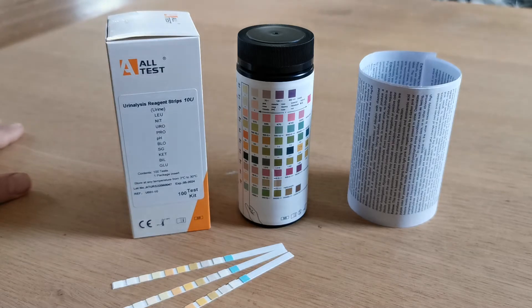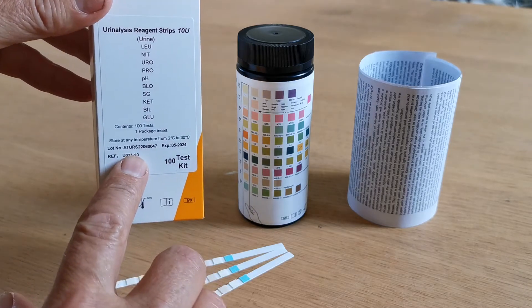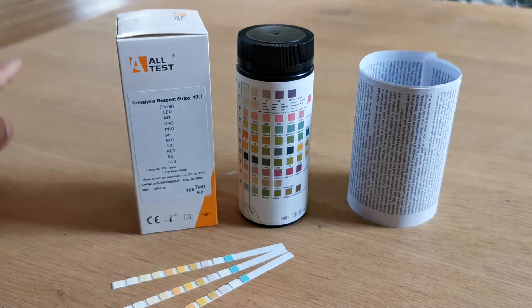That will ensure longevity, but as with all urine testing strips, within the parameters of the expiry date which will be listed on the side of the vial, once that foil is broken, the manufacturer's recommendation is to use the test strips within three months. If you keep the lid on and dry and the test strip pads don't absorb moisture, they should last longer, but the recommendation from the manufacturer is three months.